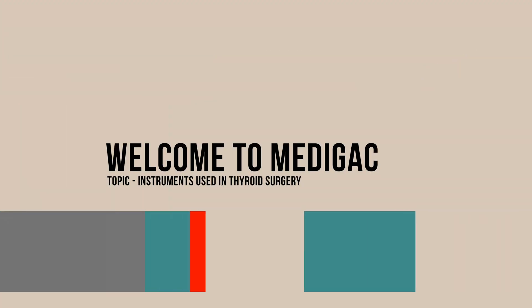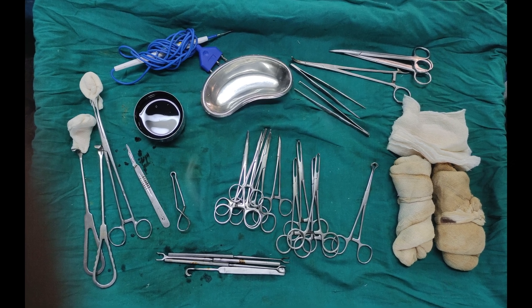Hello everyone, welcome to Medigac. Today we are going to see the instruments used in thyroid surgery. This is the set we mainly use for thyroid surgery.